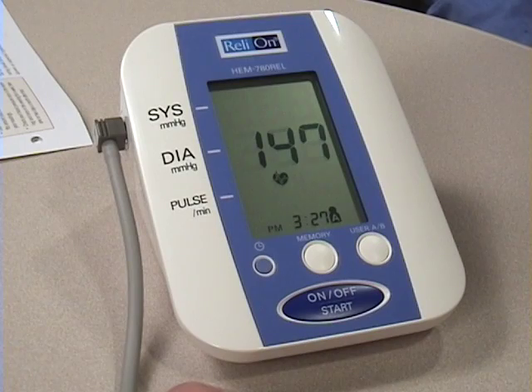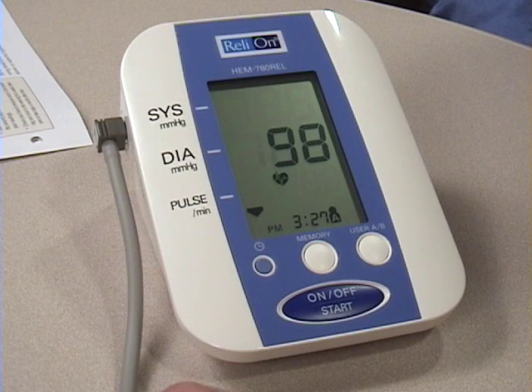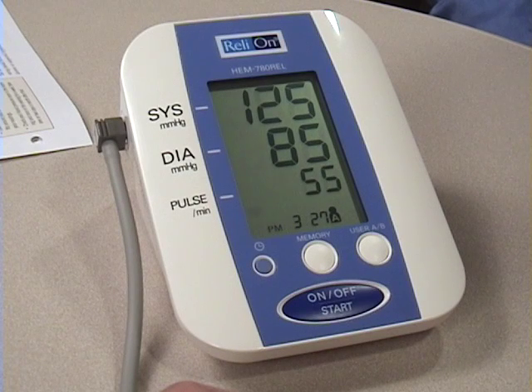The cuff automatically inflates, and as it does that, it compresses the brachial artery, shutting off blood flow through that artery. Then as the cuff deflates, it measures the first time that blood can flow through the artery, and that's your systolic blood pressure, the top measurement. The next measurement is the time when there's no resistance, and that's called the diastolic blood pressure.